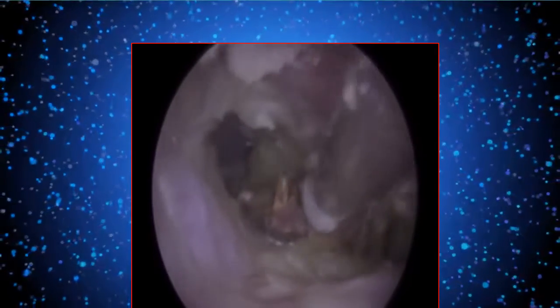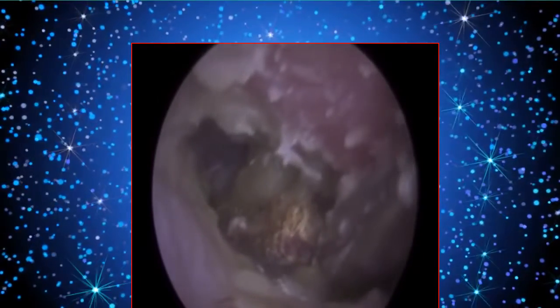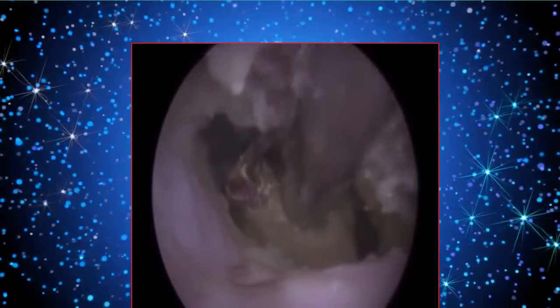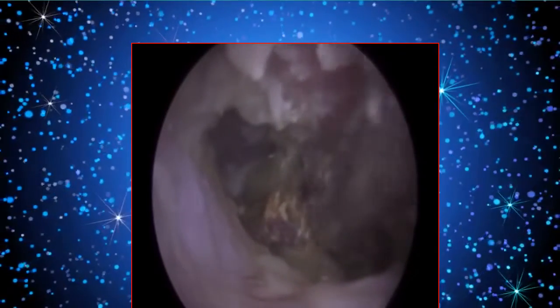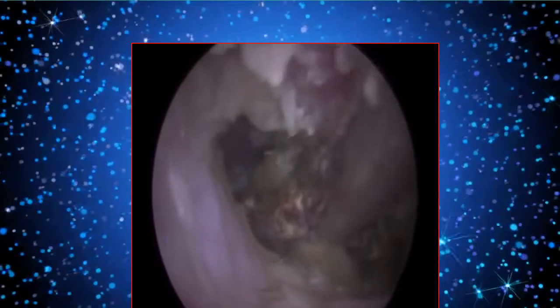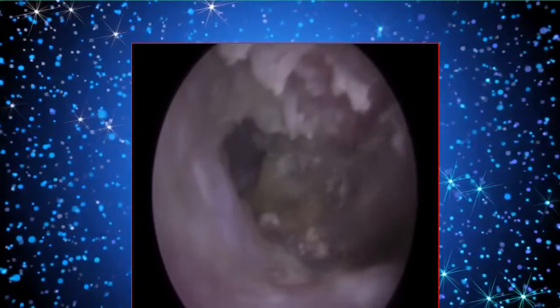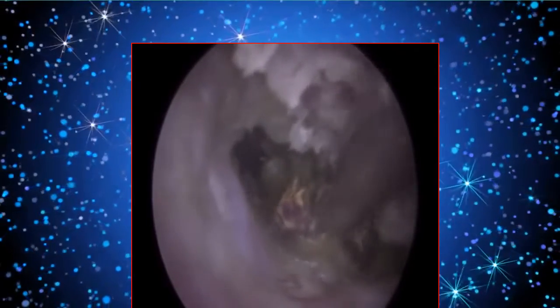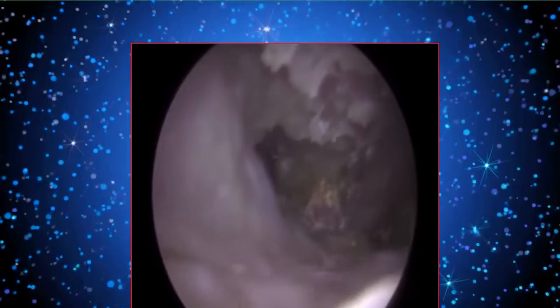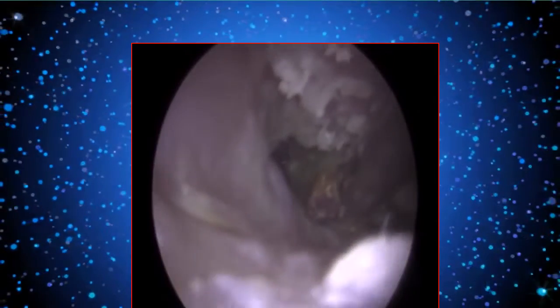If you probably saw before, I was suctioning a lot of debris, a lot of infected discharge. And we've got this infected debris that's lodged in the isthmus. The ear canal has two narrowings, and a narrowing in an orifice is called an isthmus. The first narrowing is where the bony part of the ear canal and the cartilage part meet, so the osteocartilaginous junction, probably about 1 centimetre into the ear canal. And there's a second narrowing about 0.5 centimetre, or thereabouts, near the eardrum, called the isthmus. The ear canal narrows at that 5 millimetre distance away from the eardrum, then it expands again, it protrudes outwards, and we've got this infected debris lodged beyond that isthmus, and on top of that the ear canal is swollen.